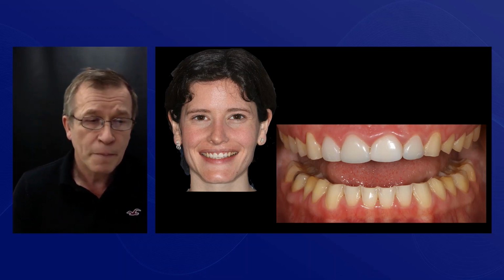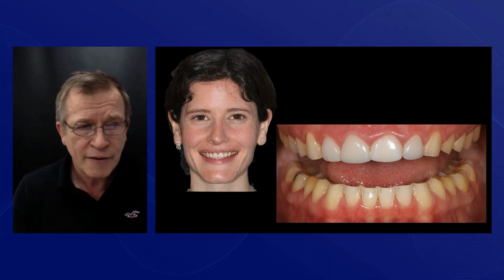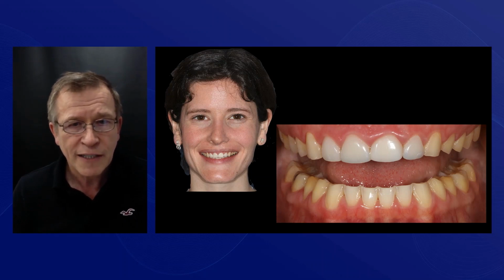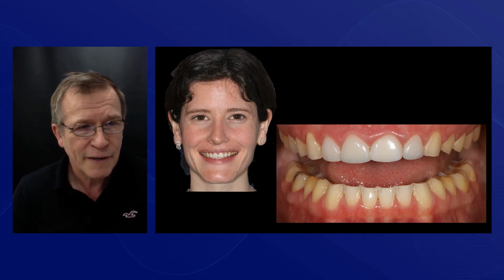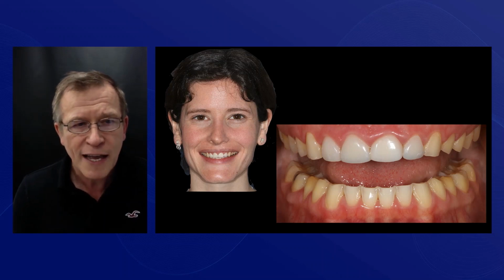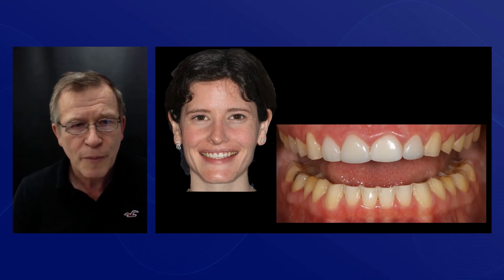We had discussions about whether this was going to be porcelain, whether it was going to be composite. She was desiring that it would be porcelain. She's an American lady. I know she's a very intelligent lady, though, because she married a fellow Liverpudlian. So I know she's smart. But she wanted porcelain on here. We could have done this with composite. Once we understand the design, the choice of the materials and the procedure is between you and the patient. But we have to understand what that design is.